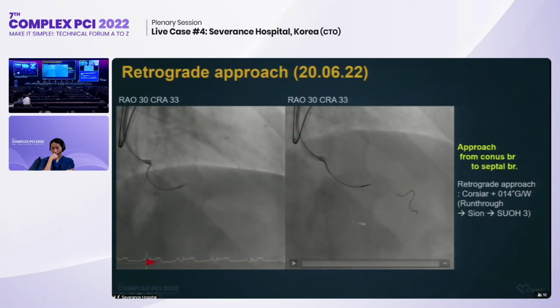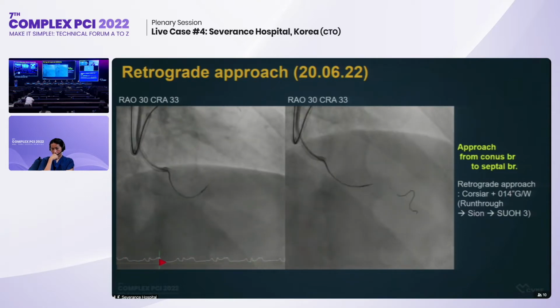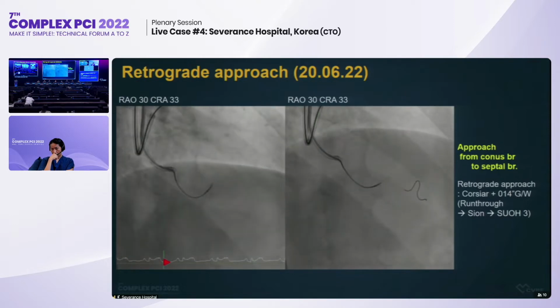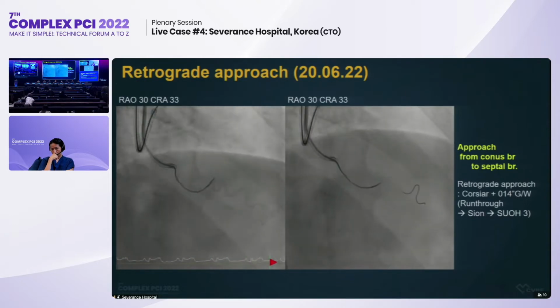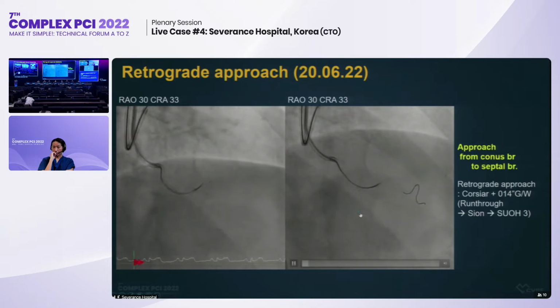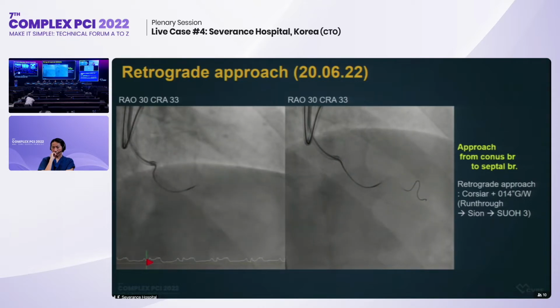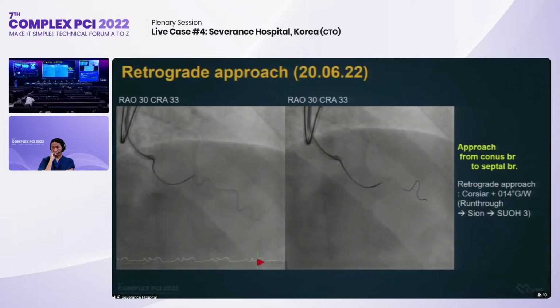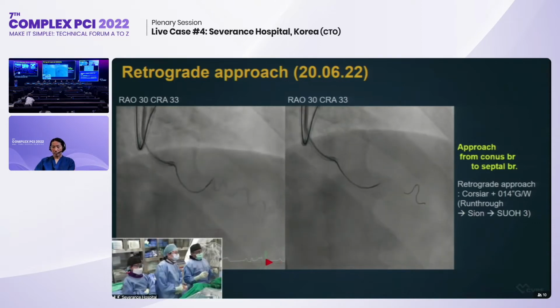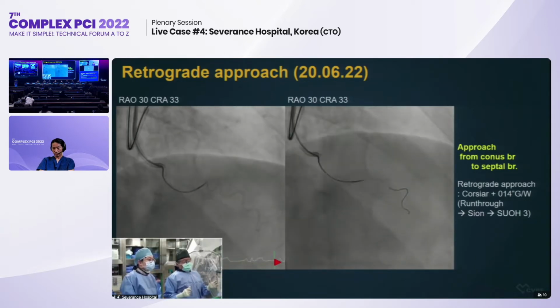This is the previous attempt at selecting the septal channel. However, it is very ambiguous, and even with selective angiography, the septal collateral is not clear. As you can see, it is a very tortuous track. This is the epicardial channel tracking from the conus branch, but as you can see, there is a tight bending and also some tortuous lesions. The wire movement had some limitation. Because of the time, and because the patient also complained of back pain, we stopped the procedure.